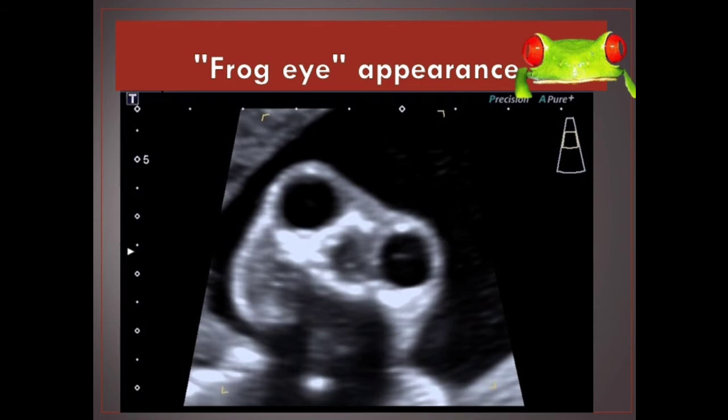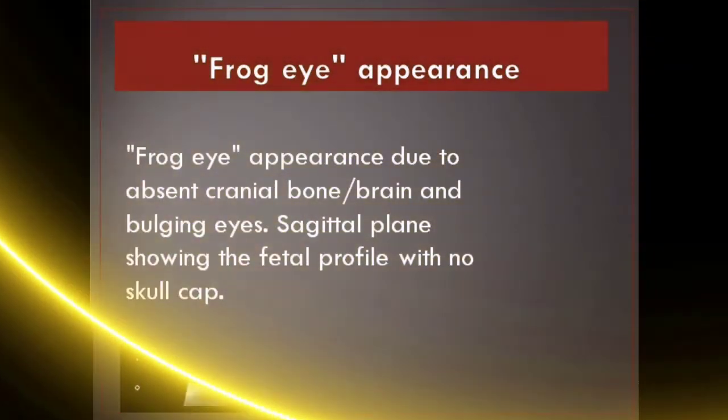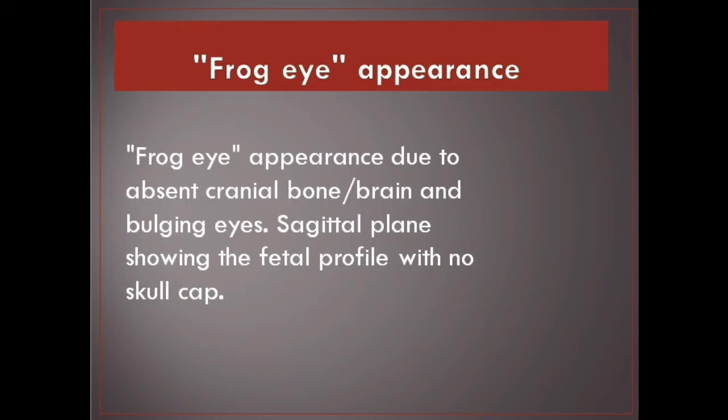Frog eye appearance — due to absent cranial bone and brain with bulging eyes. Sagittal plane showing the fetal profile with no skull cap.